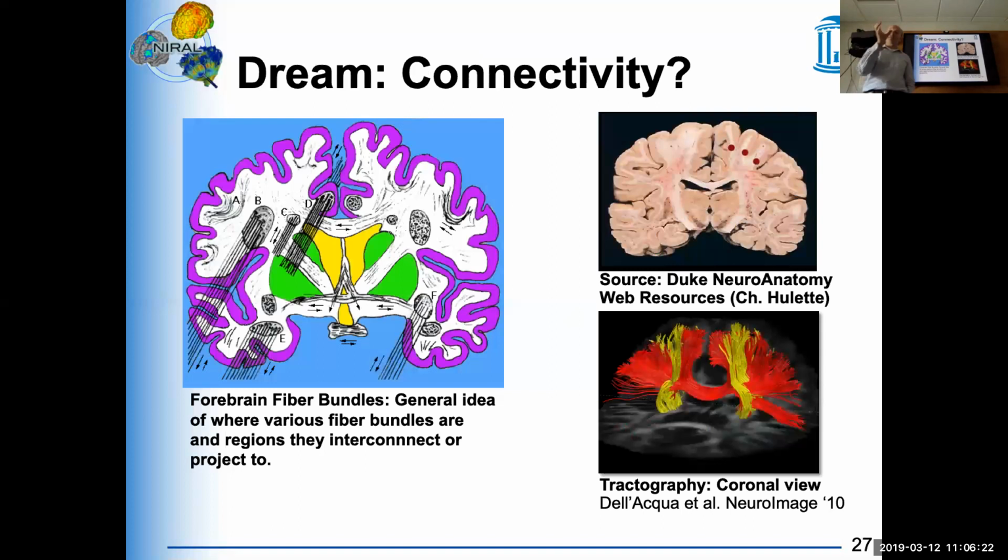So to acquire the same image at b equals 1000, we basically need half the time. Gradient strength is one thing that really impacts this, which is why those really sophisticated sequences that we currently use in the Baby Connectome, yeah, we can do them on the Prisma. If you take those and try to do them on the TIM Trio, which we tried, it's just way too long. It becomes non-feasible.